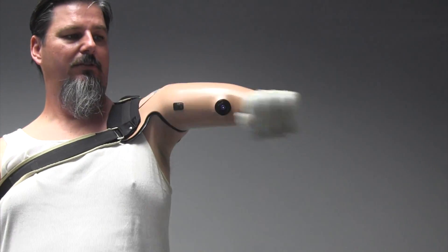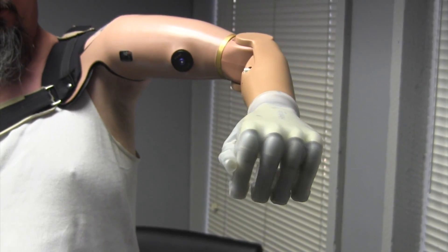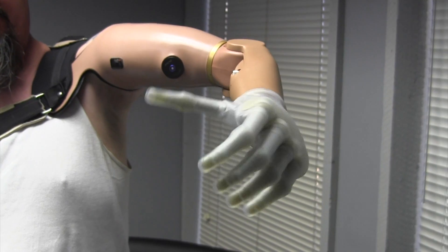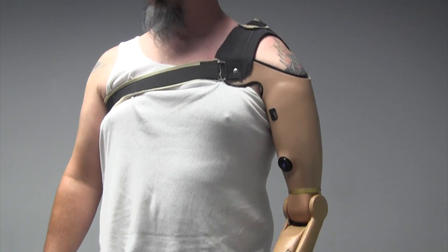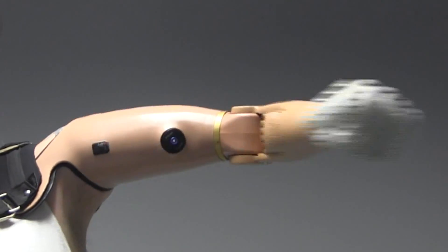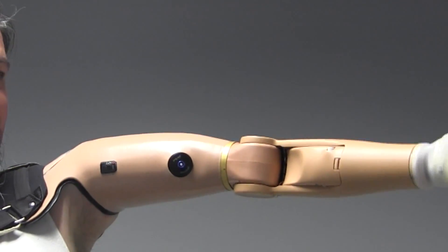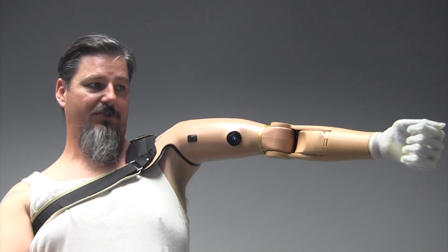I've got great control. I can open and close up here. But that was one thing I couldn't do before — leave my arm out and either bend the elbow or any of these movements. As soon as I raised my arm, the arm would go out of control because the muscles all switch positions.